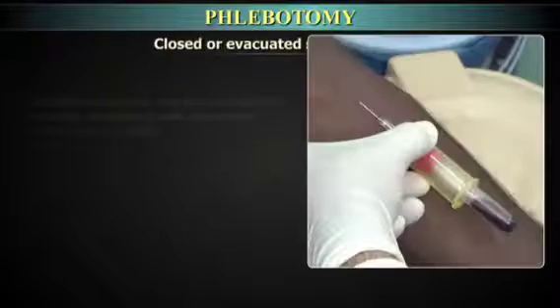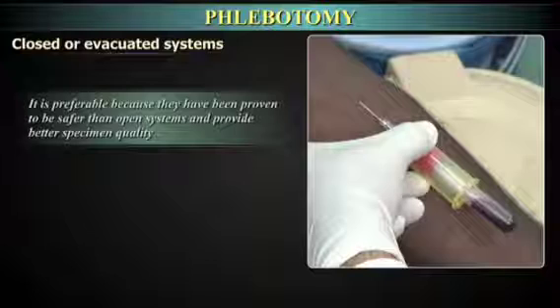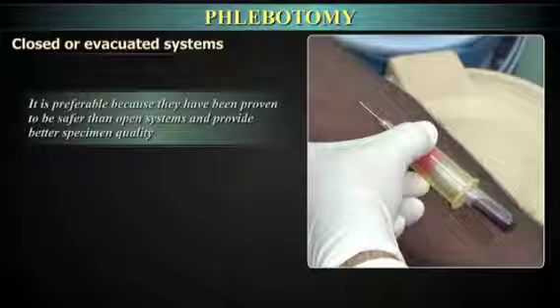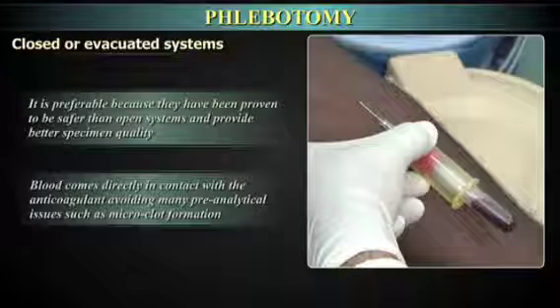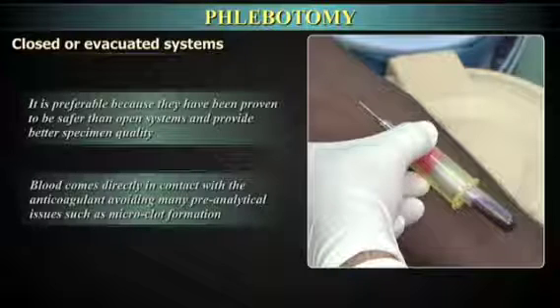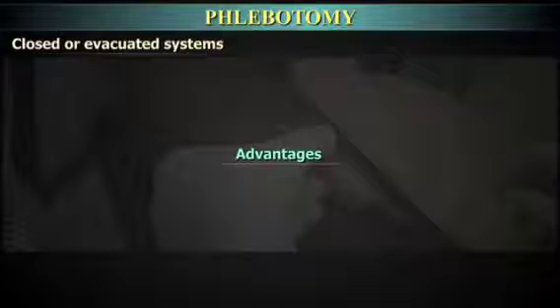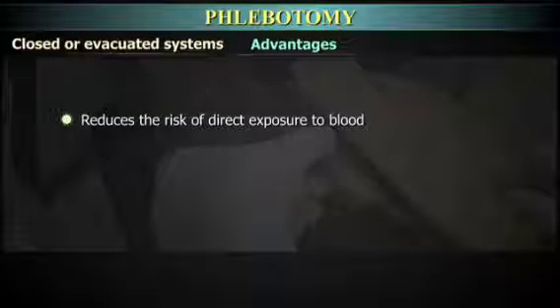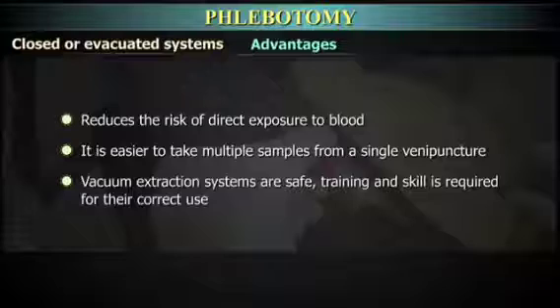The closed or evacuated systems for blood sampling are preferable because they have been proven to be safer than open systems and provide better specimen quality. The added advantage of using a closed system is that blood comes directly in contact with the anticoagulant, avoiding pre-analytical issues like microclot formation. The use of an evacuated blood collection system reduces the risk of direct exposure to blood and makes it easier to take multiple samples from a single venipuncture. Although vacuum extraction systems are safe, training and skill is required for their correct use.